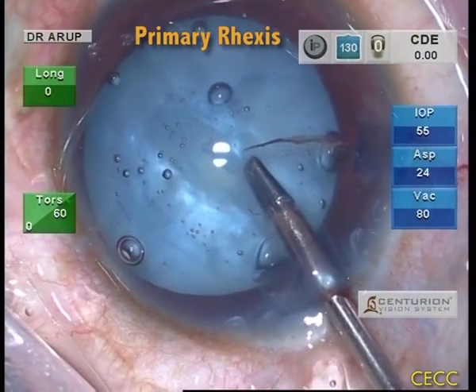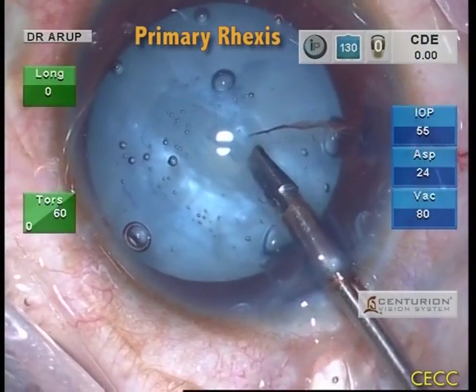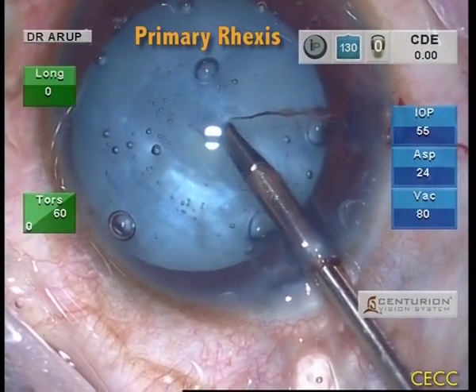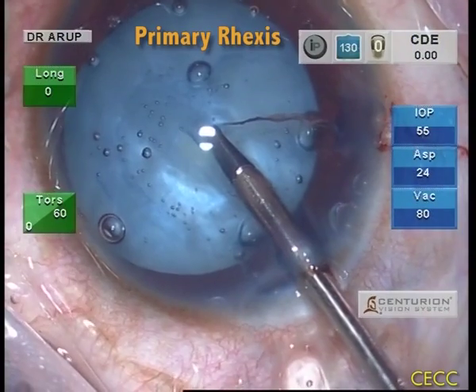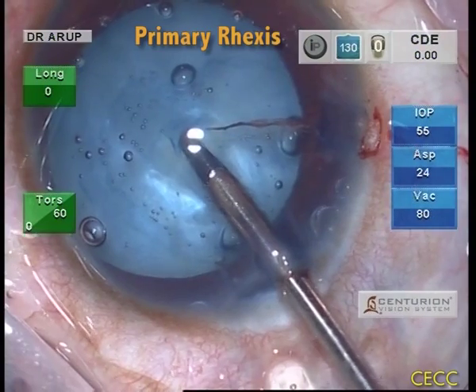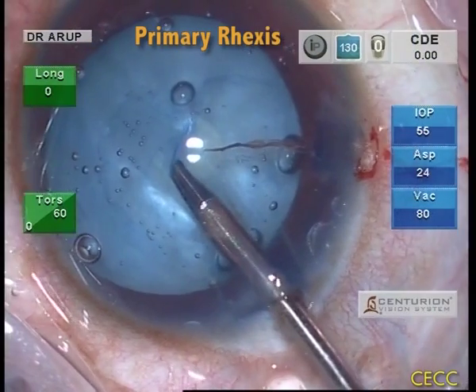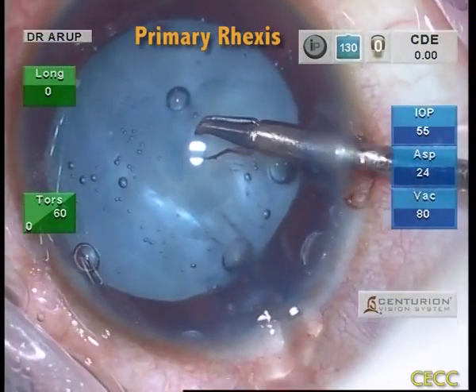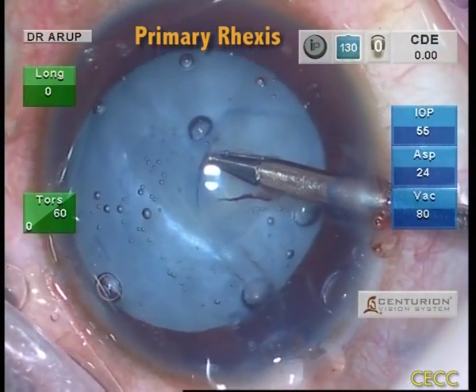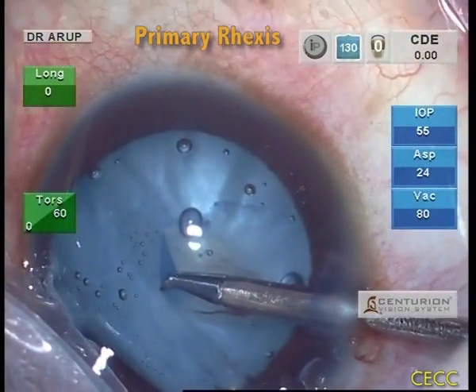Due to ergonomic issues, we chose to continue the RHEXIS not through the inferior paracentesis but through the main incision during the initial stages. Once the tear moved towards the superior half, the inferior paracentesis was used for further manipulations. The flap was carefully and slowly torn to give a continuous RHEXIS.